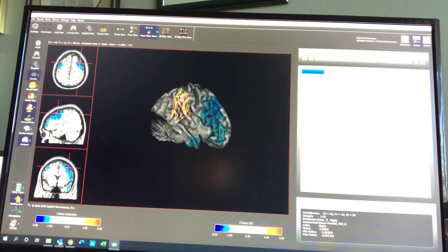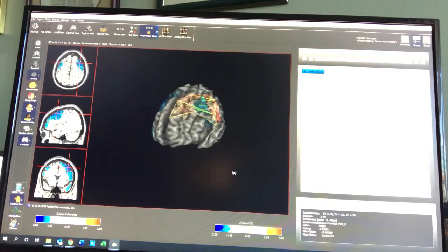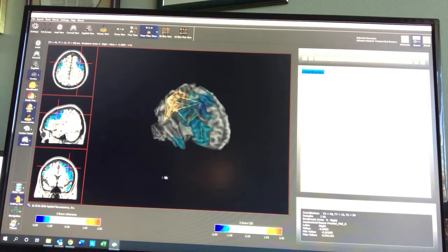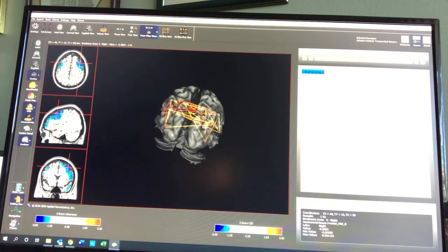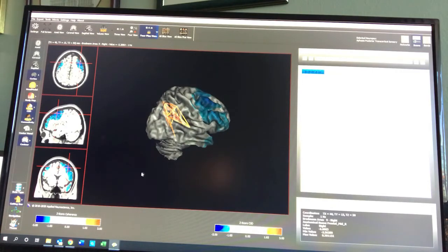But we also see a lot of lines. These lines are showing us what's abnormal in terms of the connectivity, or what we call coherence. What is abnormal connectivity in the posterior region and transcortical region of this person's brain. When these lines are here in the red, oranges, and yellows, they're showing us the over connection between these particular regions of the brain from the left to the right. In other words, the information being shared is not being shared very well, and it's stuck.